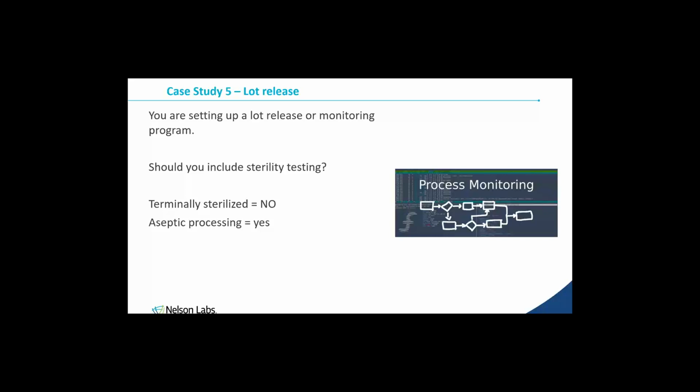Yes, it is appropriate. Well, I've got a wrench to throw in here for you. Let's say you've got a notified body and you're trying to do your submission and you're following the standards, doing what you think you should. You send this file away and the notified body says that they want to see a sterility test.